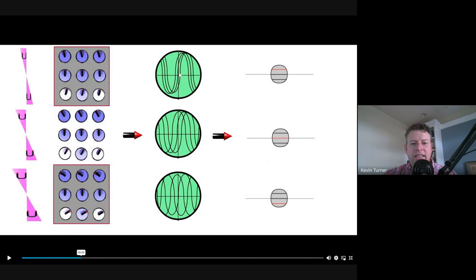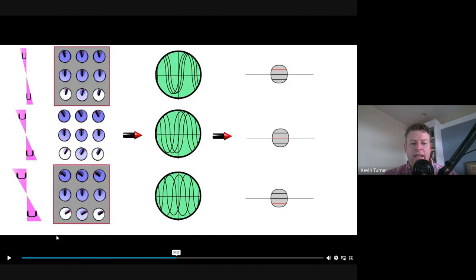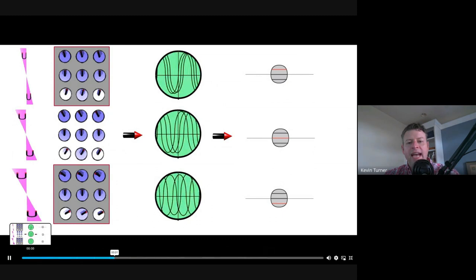So you can see here, these different shapes are coming from the different protons. The computer can read these different echoes. Sorry, this animation goes really fast. You can look at these different shapes, and that's where the encoding is coming from. The strength of the gradient is altering them.